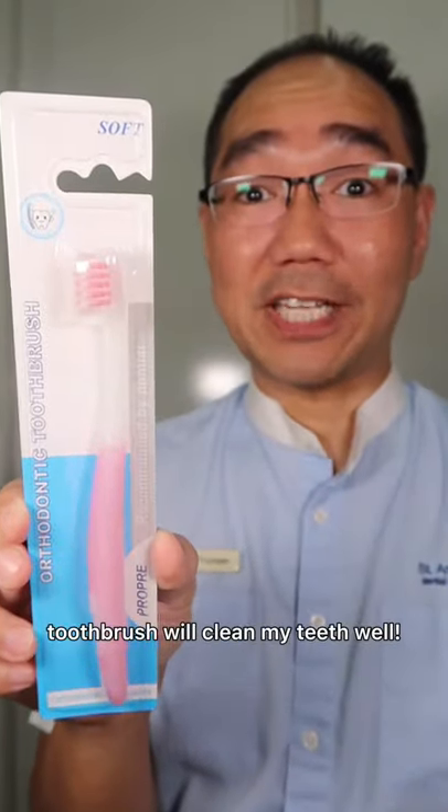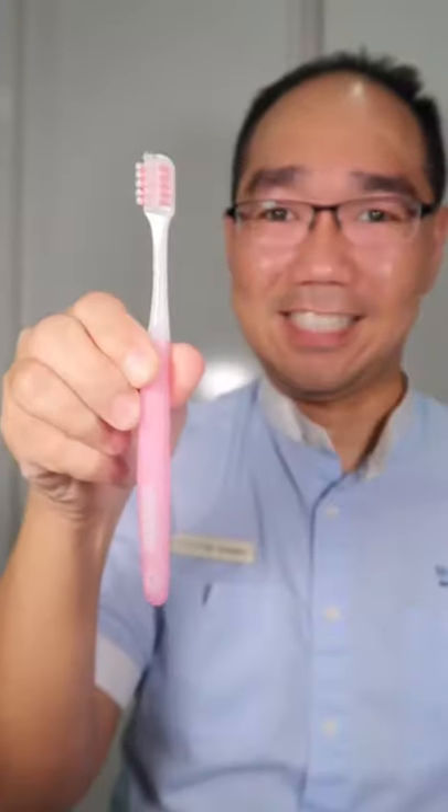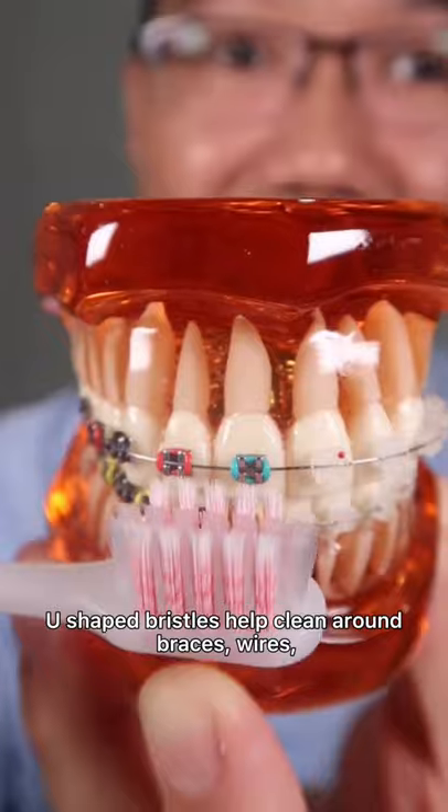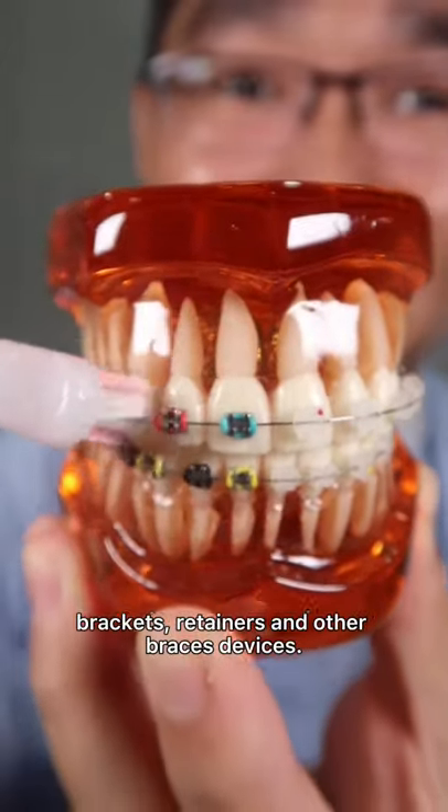Let's find out if this braces toothbrush will clean my teeth well. The U-shaped braces toothbrush helps clean around braces, wires, brackets, retainers, and other braces devices.